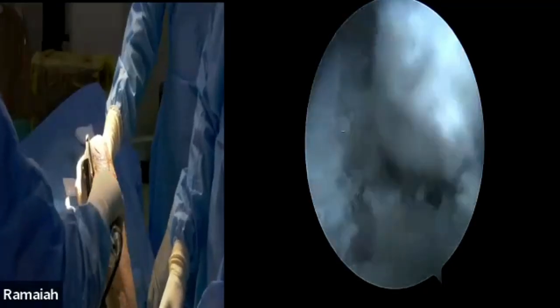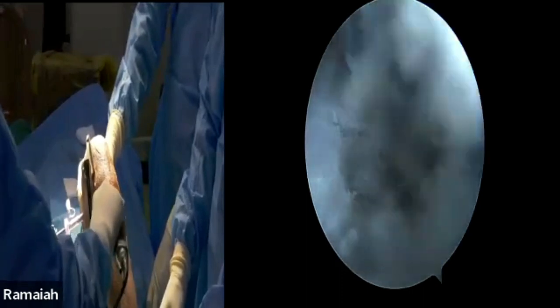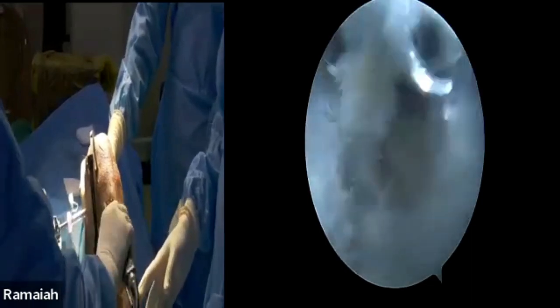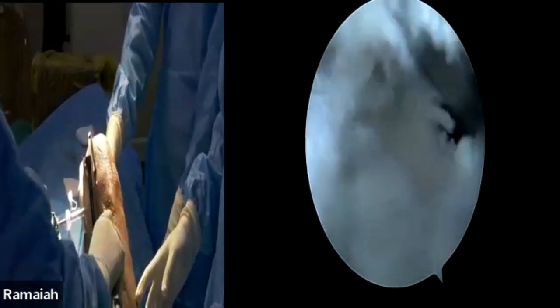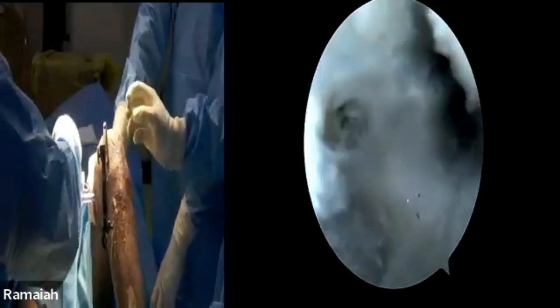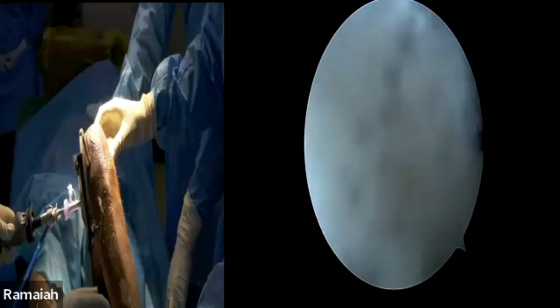Now we'll prepare the top portion of the tibial tunnel — do some kind of blunting, reaming, or rasping so that the killer curve becomes a little smoother and there is no bony edge which can damage the graft once you pass it inside. The tibial tunnel is now clear. Get the suture we have loaded.